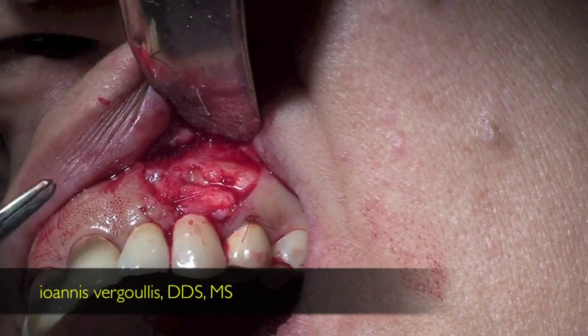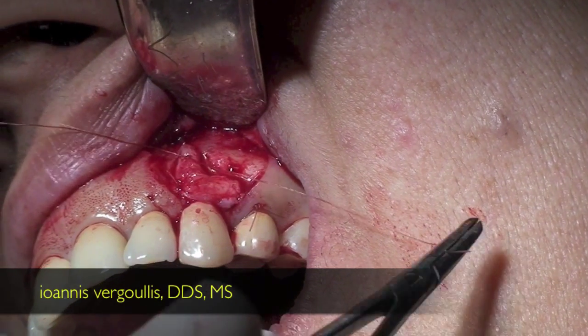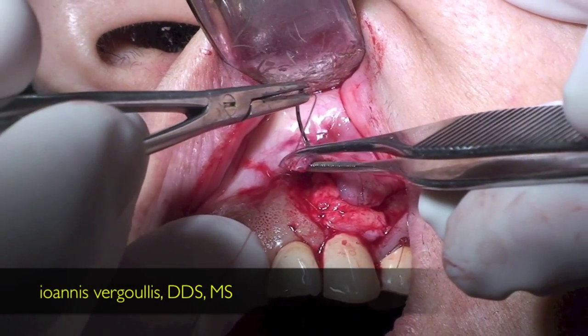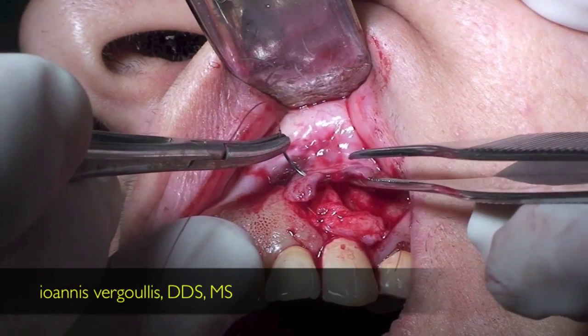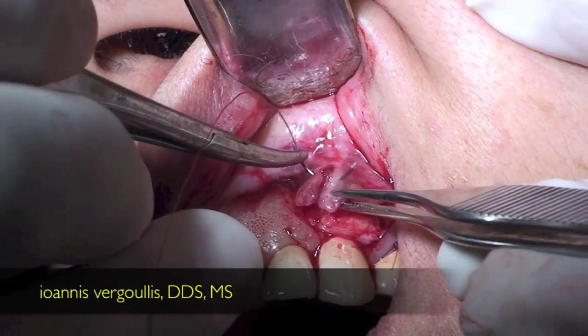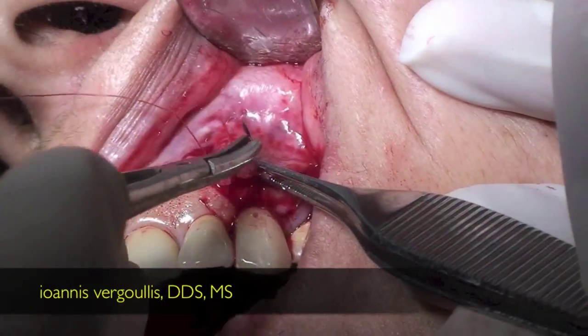Finally, we do a periosteal suture in order to stabilize the graft in the final position. At this point, we connect the two papillae. The two sides of the papillae that will be connected have been de-epithelialized. And we utilize again 5-0 chromic gut suture.